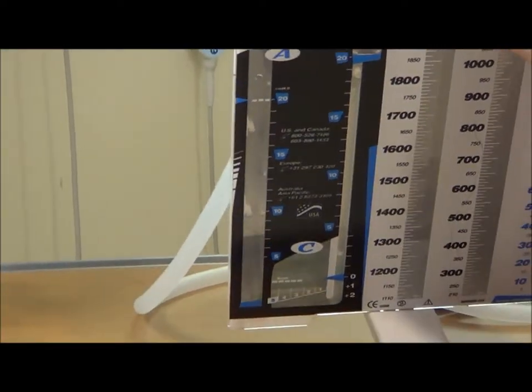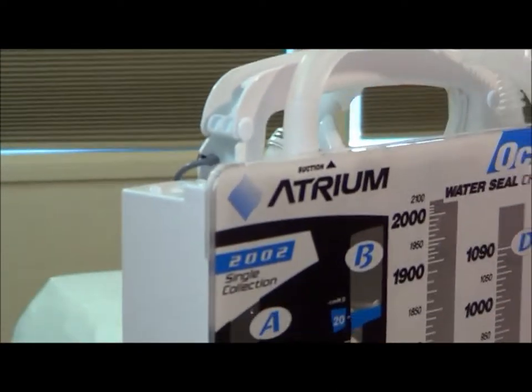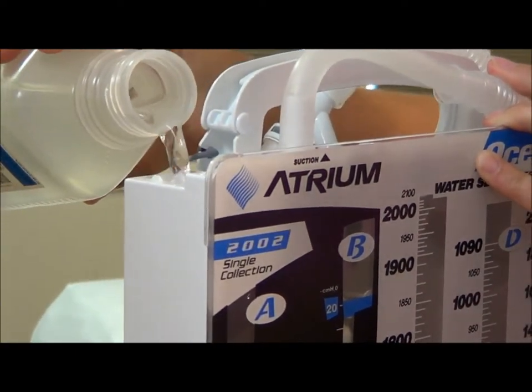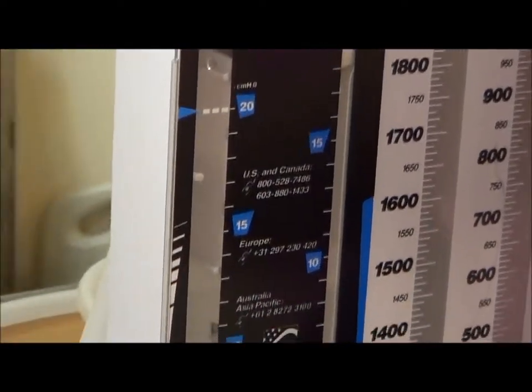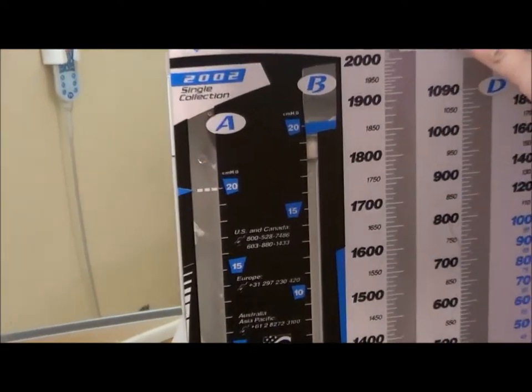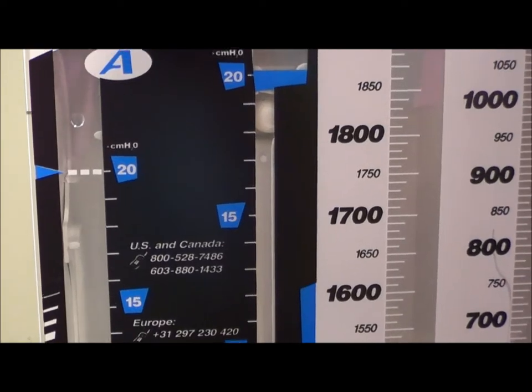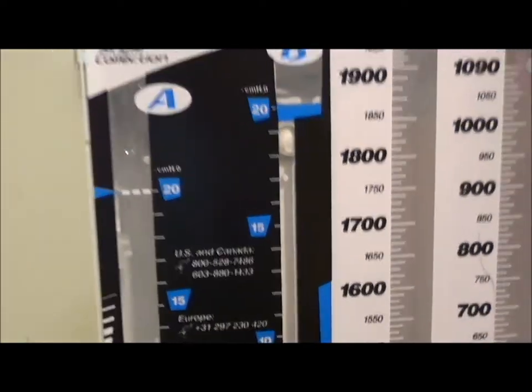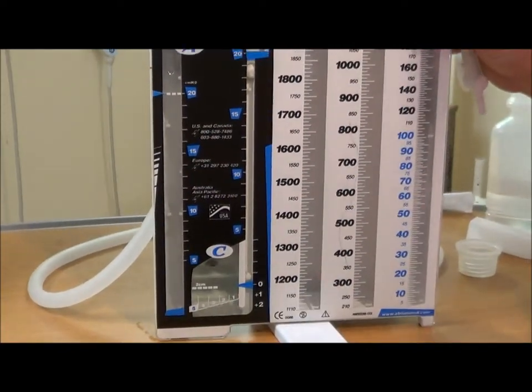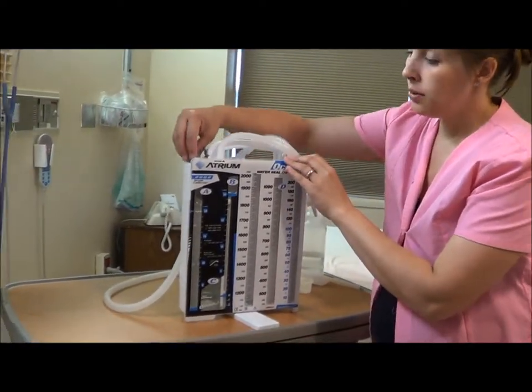To do that, remove the gray cap from the top. You can use this funnel to help pour it in, or you can just pour it from your bottle. With a new chamber, both of these will turn a bluish color once you pour the fluid in. Since this has been a training chamber, we don't have that blue dye, but usually you will see both chambers turn blue so you're able to see the water line easier. Put the cap back on.